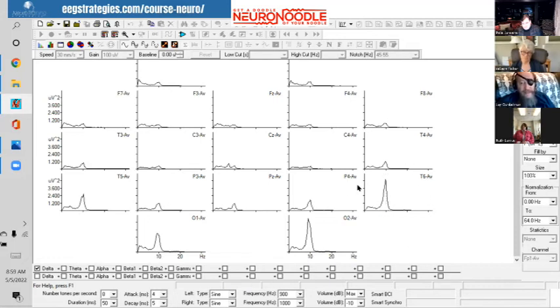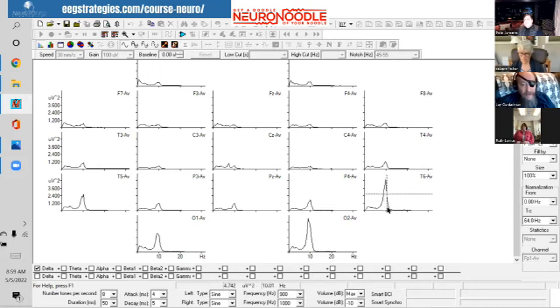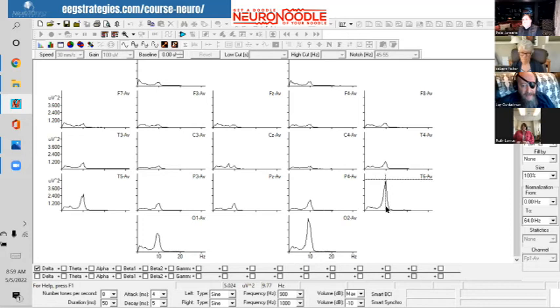Anyway, this biomarker is a major feature. When you see this, you can predict that the individual has social perceptual problems.